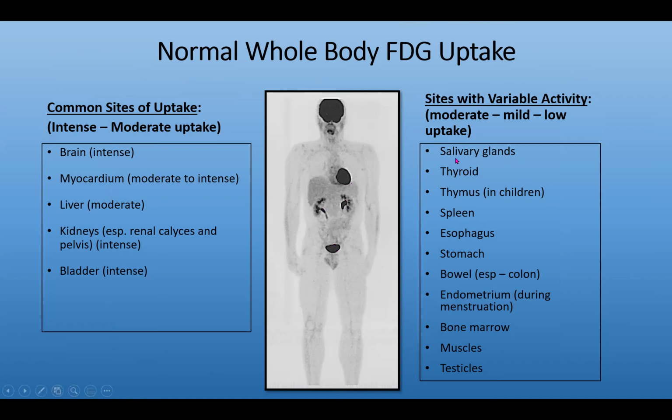In terms of the sites that have variable activity, these sites can have anywhere from low to mild to relatively moderate uptake.